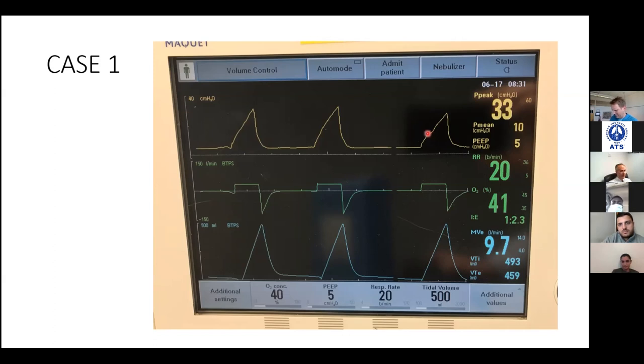Now be careful, because there are some advanced modes where the monkey might be twirling the knob inside and changing things breath to breath, but that would be a really sneaky thing to do, and I'm not doing that to you, okay? But the best way to tell is to look at this flow tracing and see, yep, this is a straight line, razor straight flow there, okay? You're not going to see that in a pressure control mode, right? It might approximate this, but it's going to have some variability, sort of like these have variability.